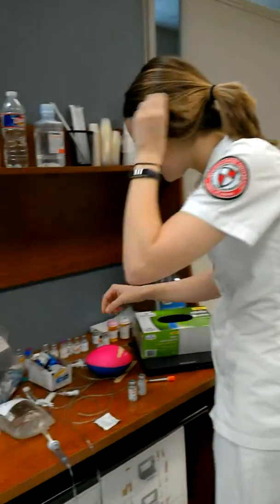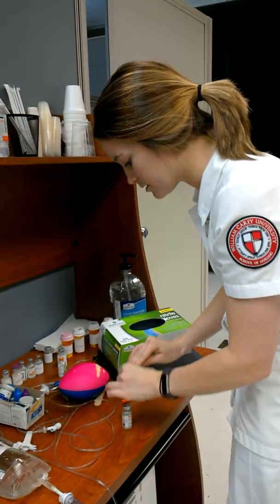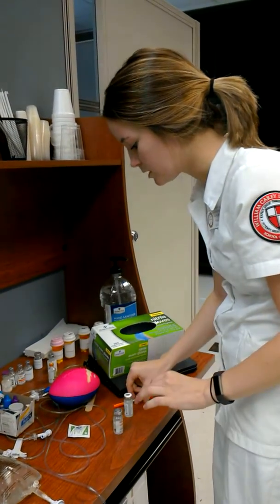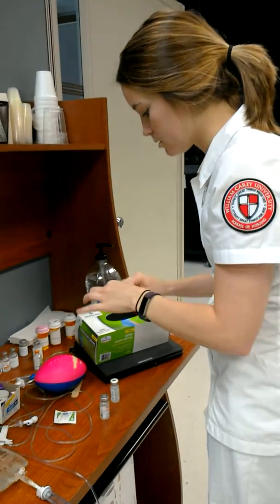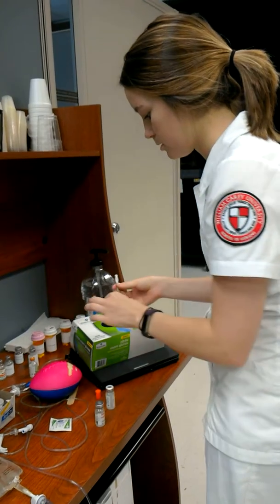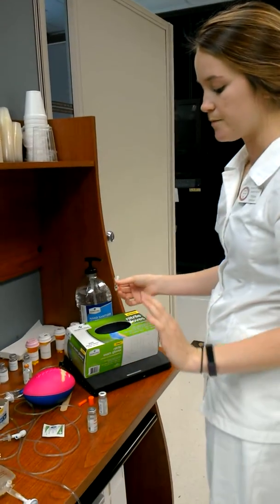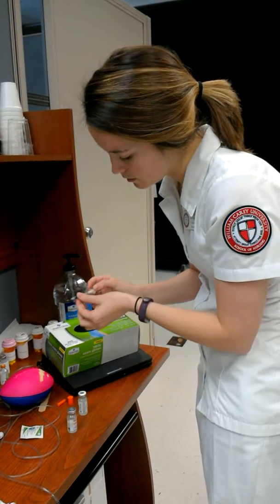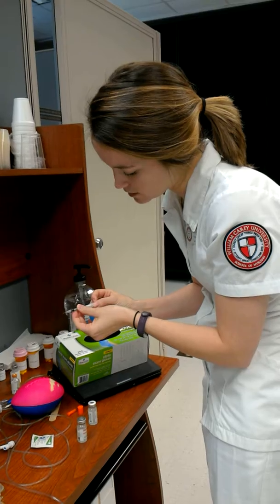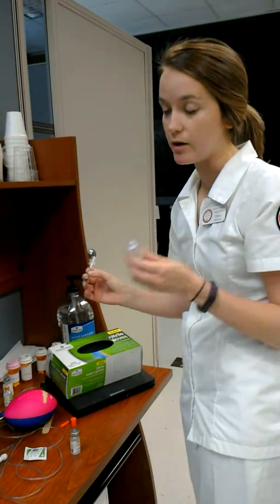So I'm going to take my little alcohol pad, and I'm going to clean the tops of my insulins. And then I have my insulin syringe. So uncap this part. So it's going to be clear before cloudy. So I will take this and draw up 5 units of air that I'm going to put into the cloudy.